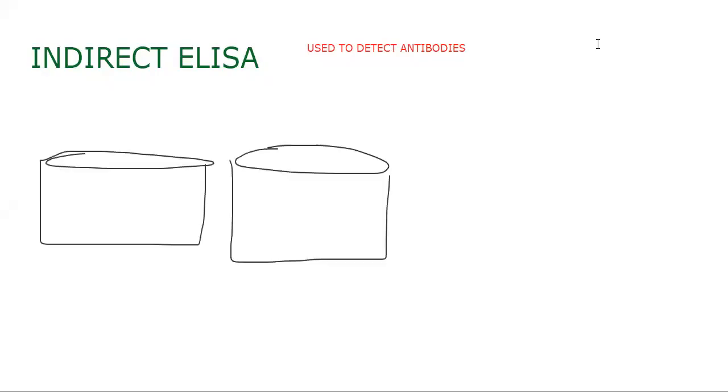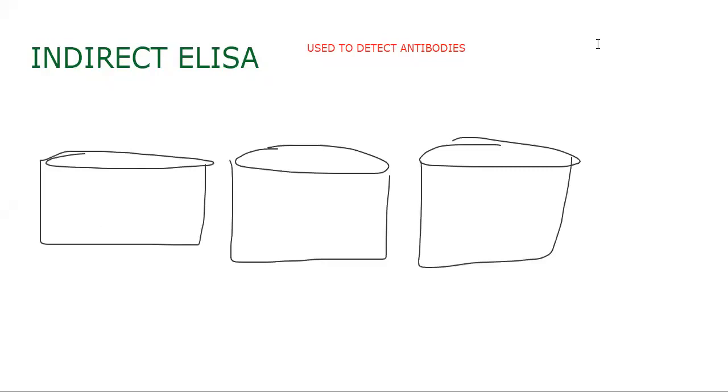So for that, what do we need in the laboratory? We need antigens. Now let me draw that same microtiter plate, with the antigens. When we are testing for HIV, the HIV virus antigen particles should be in the laboratory.